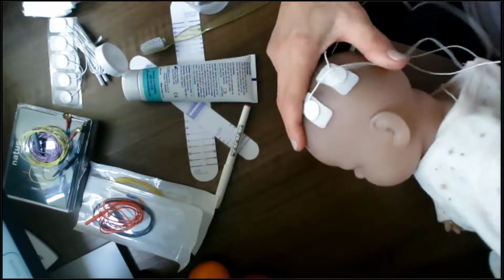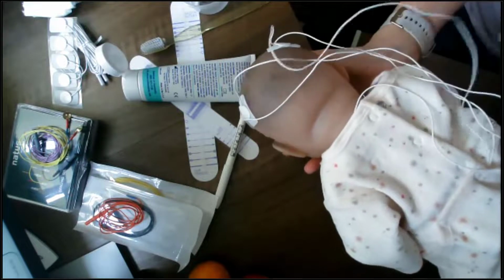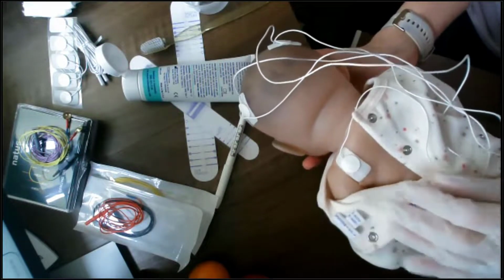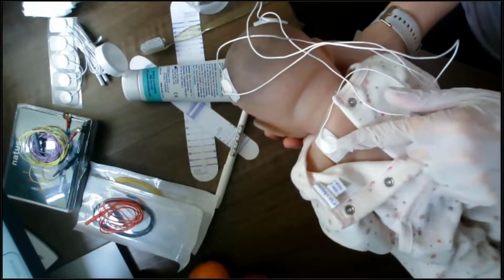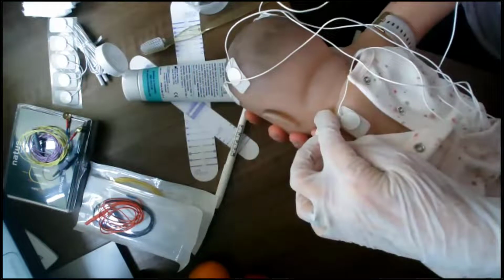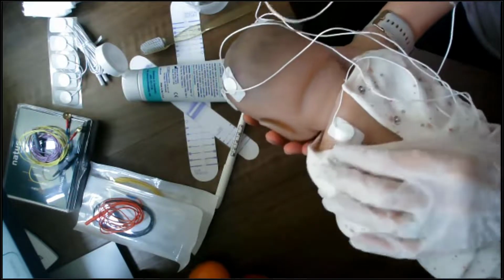Now the ground or reference electrode. Clearly if I had a proper real baby here, I wouldn't be turning her face down into the prone position like this, but hopefully you all appreciate this is for demonstration purposes only. You can see that I've got my ground or reference electrode on the back of the baby's shoulder, but like we mentioned, you can put it here behind the ear, or you can put it onto the front of the chest.